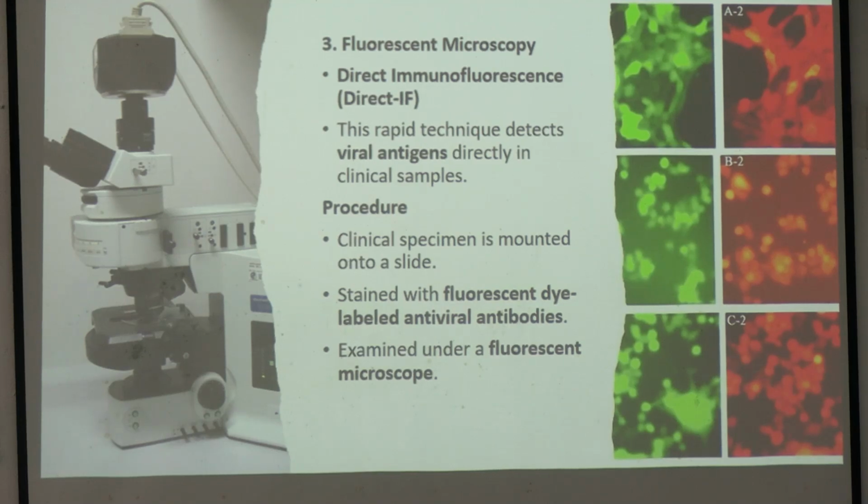This is the basis of testing for ANA also. Okay, ANA is an immunological test that we do, but এটা ভাইরাসের ক্ষেত্রেও করা যায়, এটা অনেকের ক্ষেত্রে করা যায়, ব্যাকটেরিয়ার ক্ষেত্রেও করা যায়। So any test which is immunofluorescent microscopy means fluorescent dye দিয়ে ট্যাগ করা আছে the antibody, that antibody binds with the antigen in the sample and it gives a fluorescence. এই যে fluorescence গুলো দেখতে পাচ্ছ, so these are all the fluorescence of the positive samples.